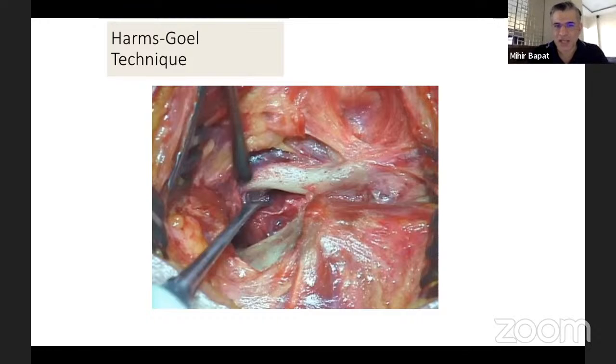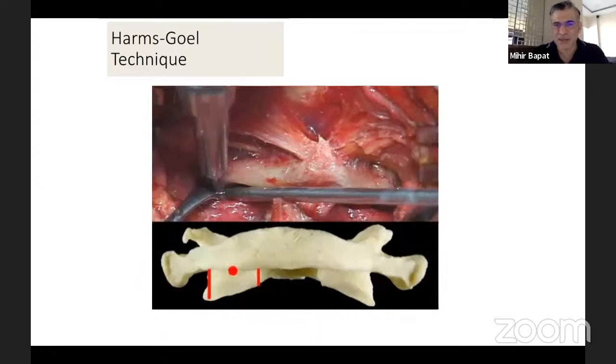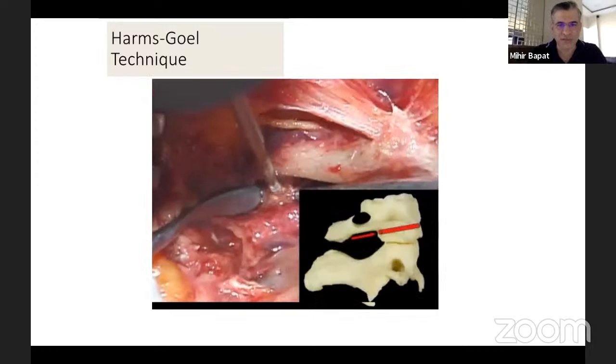One assistant can safely pull down your epidural plexus. He has to be a knowledgeable assistant, of course. And as you dissect around it, you can actually define your C1 lateral mass. You can burr the inferior edge of your posterior arch to give you access. Then you can place a sort of self-retaining sleeve there, and then drill through the sleeve and straight away enter your C1 lateral mass in a stepwise manner. If you just follow the inclination of your posterior arch, you are invariably correct.